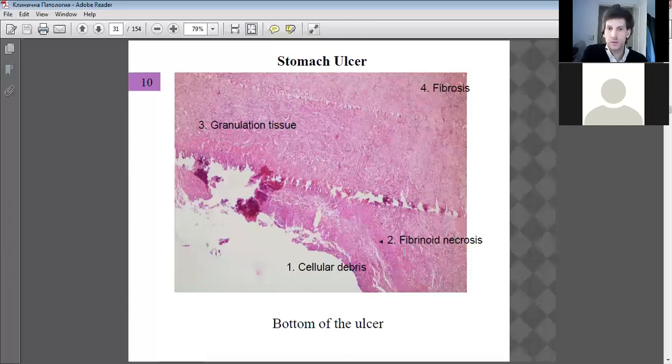Fibrinoid necrosis is also beginning, and it tends to start with the darker areas, little patches there, there. Some little patches dotted around. You need a high magnification for it. But as the cells start to die, so they necrose as well. So there's quite a lot of atrophy here in this particular section.